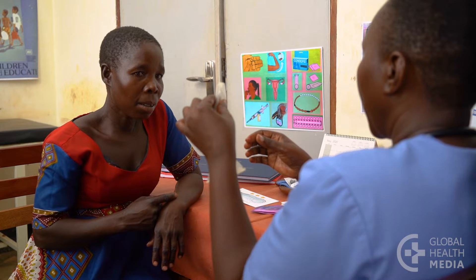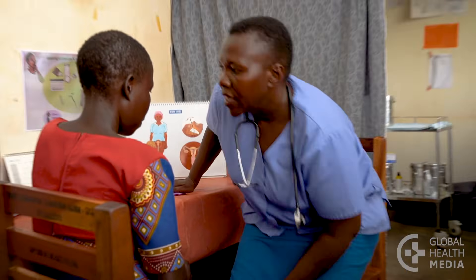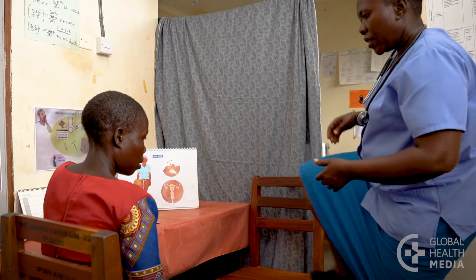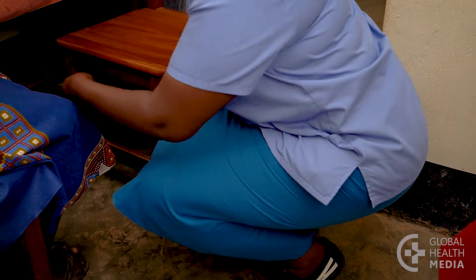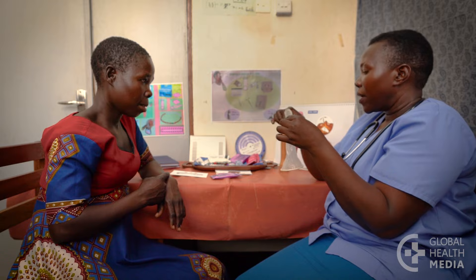This type of condom is easy to use, but it takes a bit of practice to get comfortable with it. Show her a few positions that will make insertion easier, such as raising one leg, lying down, or squatting. Then show how to insert the condom.